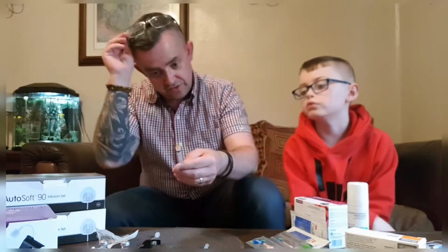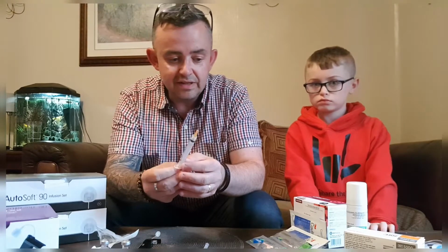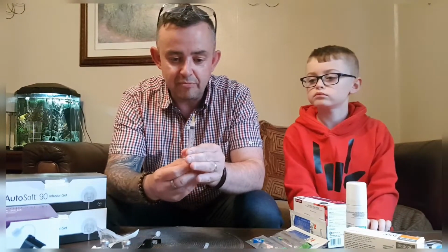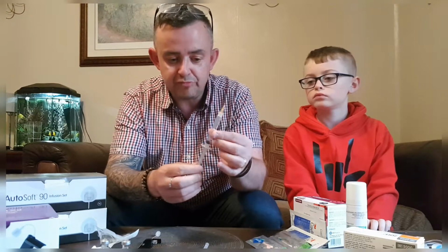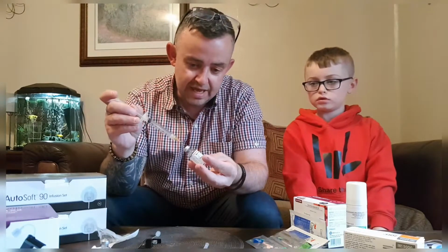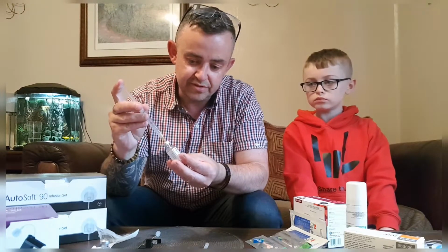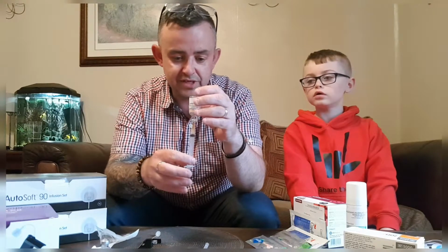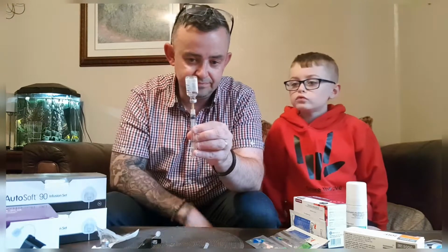Now, I use quite a lot of insulin, and as you see, that is a 3 ml syringe. So I'm going to pull that back further than 3 ml, and then just push it back to 3 ml. And then you push all that air in there, because then something clever happens. You can turn it upside down, and it puts it in itself.